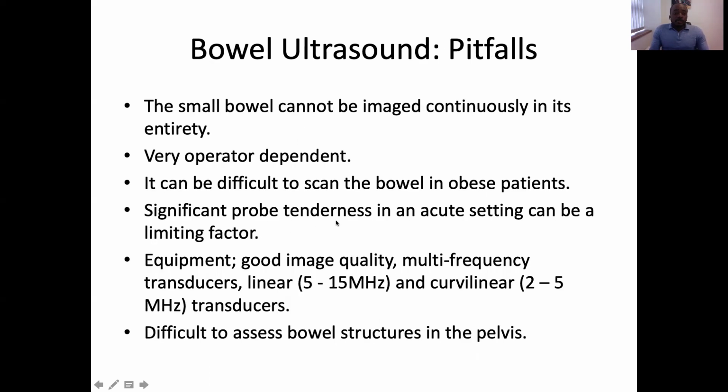Now, the pitfalls of ultrasound: the small bowel cannot be imaged continuously in its entirety. Due to the anatomy of the small bowel, we can't follow it all the way through. Ultrasound is very operator dependent. As a sonographer, a radiologist, a specialist, a doctor, you need to really know what you're doing. You need to have a lot of training to be able to do bowel ultrasound. It's very dependent on what you do and on what you know.